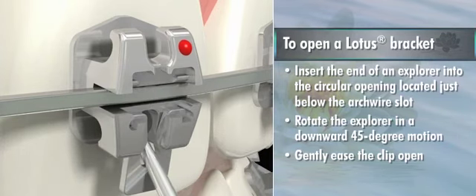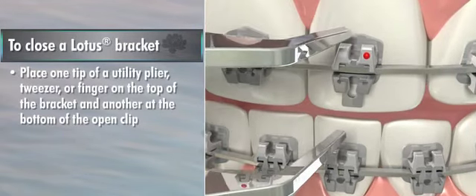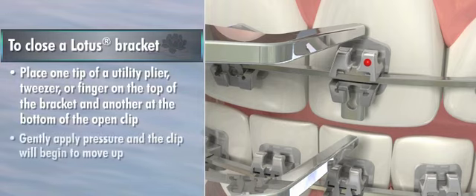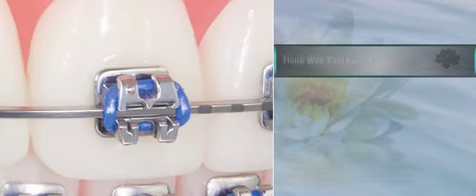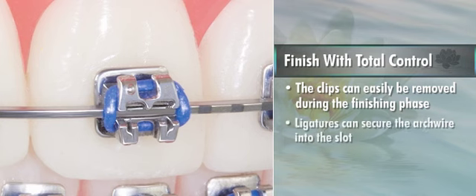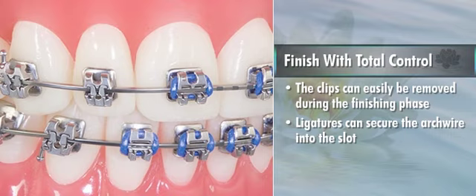To close a Lotus bracket, place one tip of a utility plier, tweezer, or finger on the top of the bracket and another at the bottom of the open clip. Gently apply pressure and the clip will begin to move up. The clip will click when it disengages from the bottom lock and will click a second time once the clip is fully closed. If desired, the clips can easily be removed during the finishing phase and ligatures can secure the archwire into the slot, giving you total control over the finishing process.